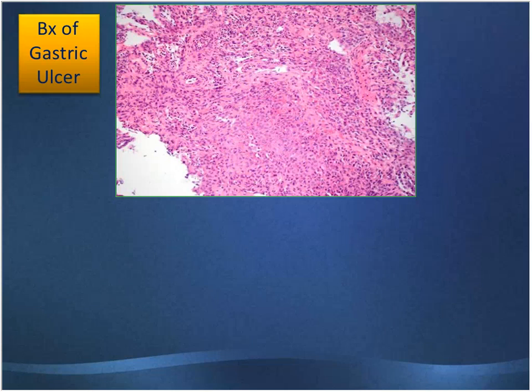On this biopsy, it's very difficult to see anything different except the inflammatory cells and so forth. But paying attention to this particular area in the center of this biopsy, there are some nondescript cells which could potentially be an epithelioid gastrointestinal stromal tumor.